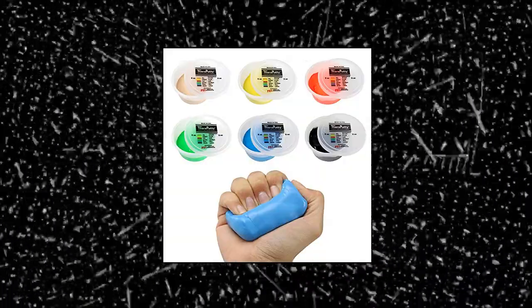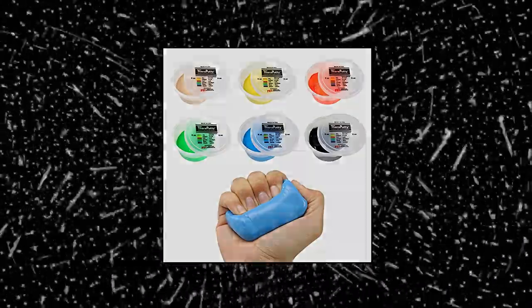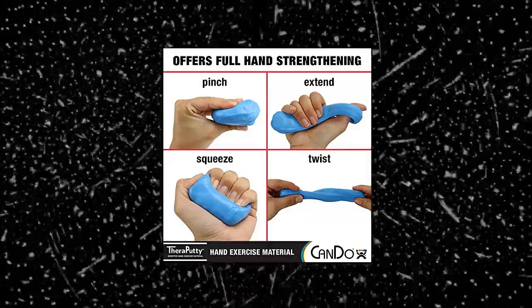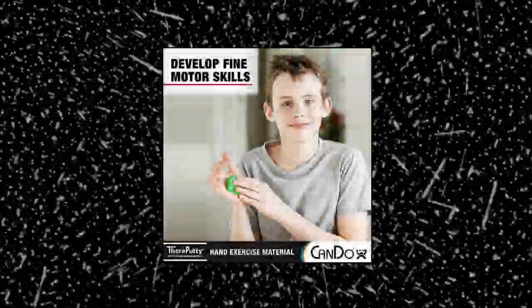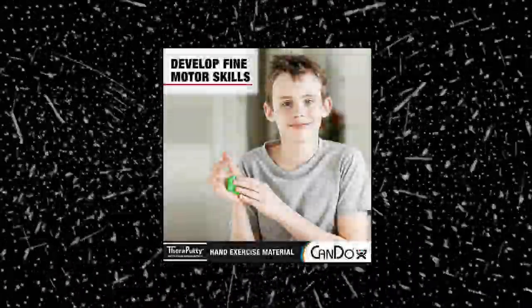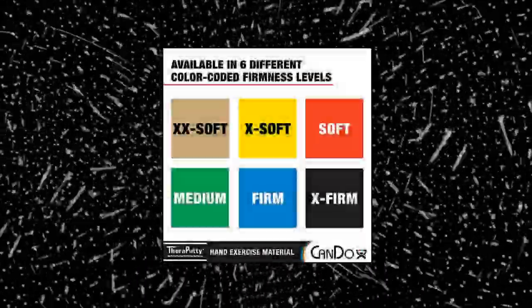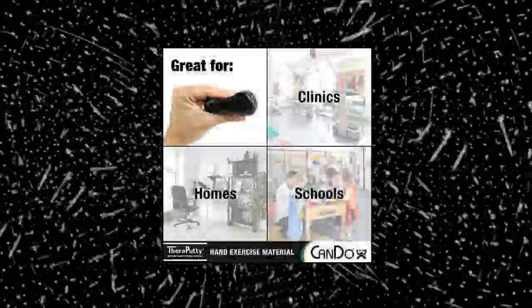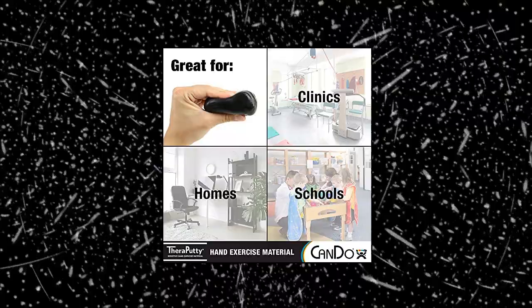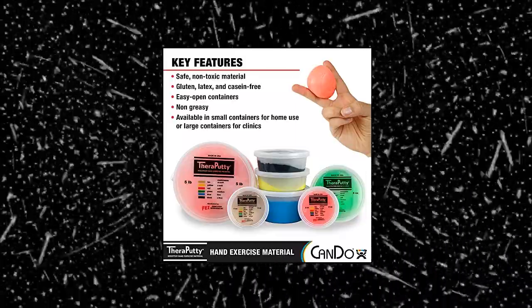Can Do Thera Putty Plus hand exercise putty for rehabilitation, exercises, hand therapy, and to strengthen your hands. Squeeze, pinch, stretch, or twist the putty to strengthen hand muscles, improve fine motor skills, and decrease stress. Used to practice flexion, extension, press, pinch, and adduction exercises. Great for everyone — people of all ages can benefit. Children can use it to develop fine motor skills or for play time. Adults can use it for hand rehabilitation, general hand strengthening, and stress relief.